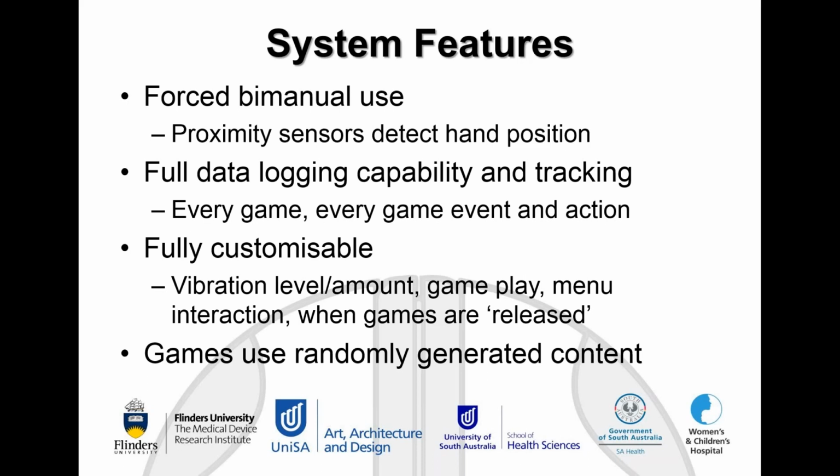The other thing was we designed our games so they would generate random content. Now what that means is if you were to play any two games back to back, then the location of the collectibles within that game, where you'd start in that game, and how that game would actually play out would be randomized every time you played it. So even if you played the same game 4 times in a row, it wouldn't actually be the same game because the track would change or the world would change, and where you collected items within that world would change. And we did this to hopefully generate the ability for the child to come back and play it again because it was new and they were discovering new things each time.